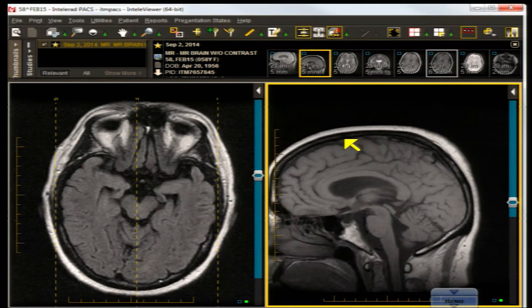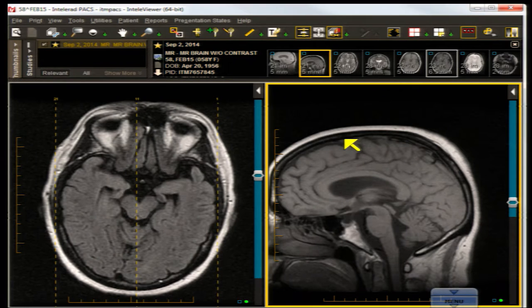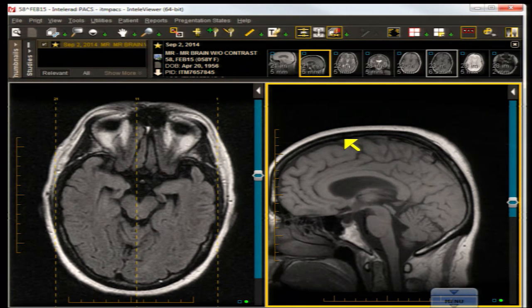In amyloid angiopathy, you expect to see a bleed within a bleed, or multiple foci of hemorrhage or siderosis — we see none. Vascular dementia would require either multiple infarcts or more severe gliosis. Multisystem atrophy is not associated with the initiation of a speech disturbance.